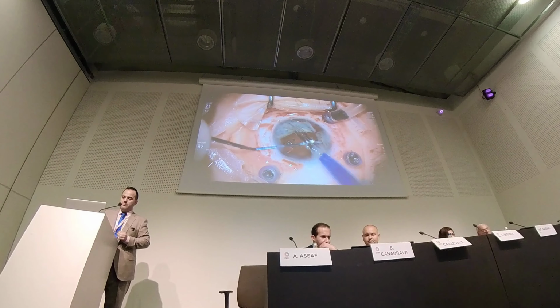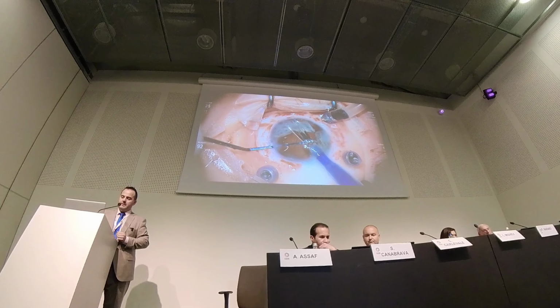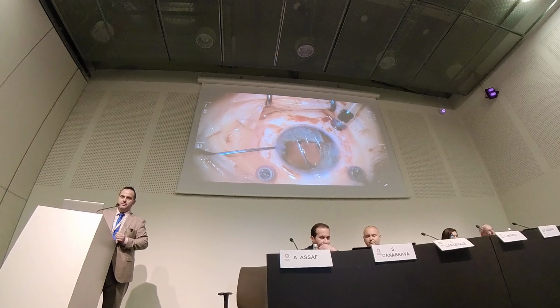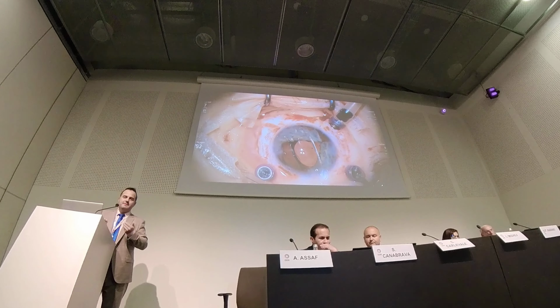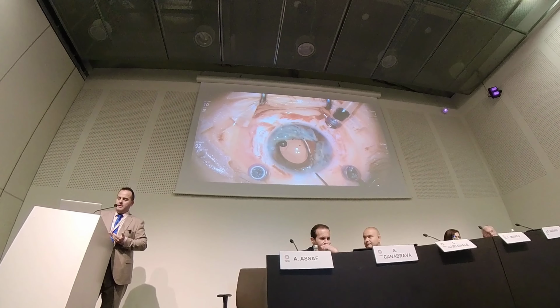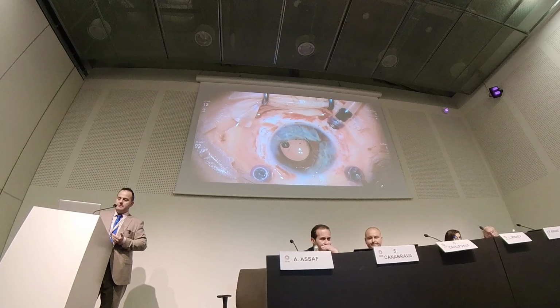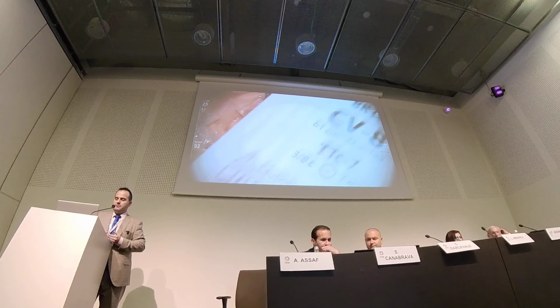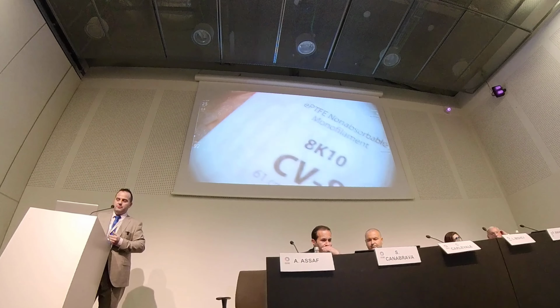Here is another complex case. This is a young child actually, and here I'm implanting the EDOF lens, which is with the same design. Basically the approach is absolutely the same, but here the eyelets are more open, so it's easier for the surgeon. This is the Gore-Tex suture.